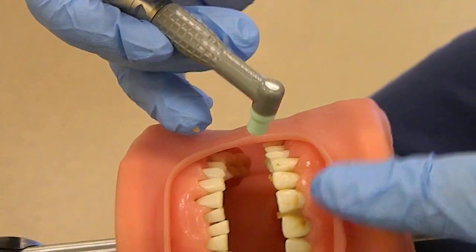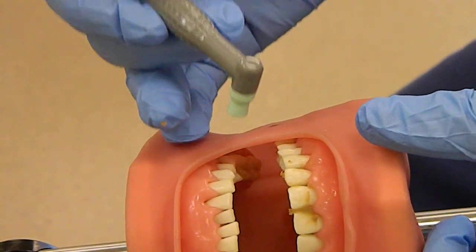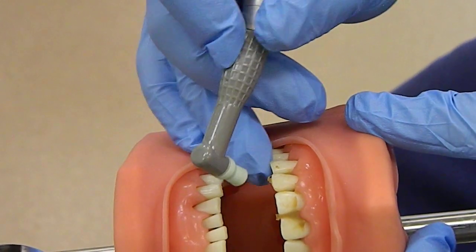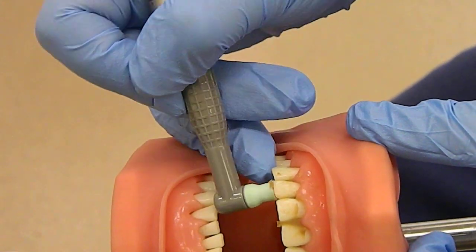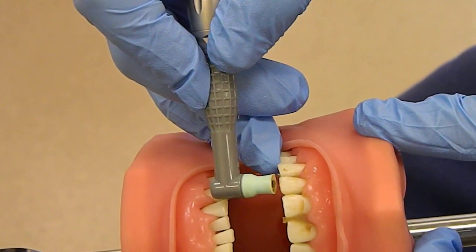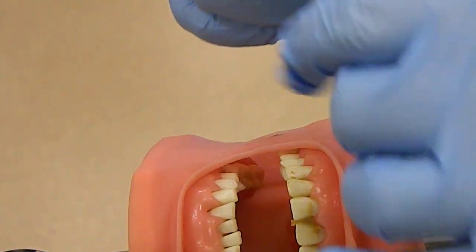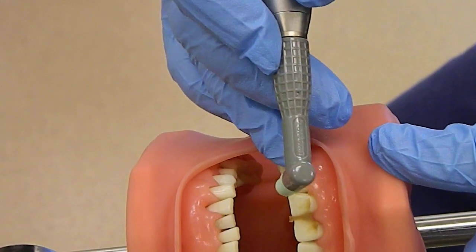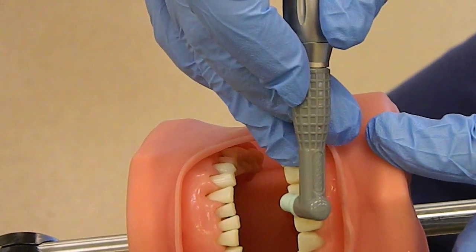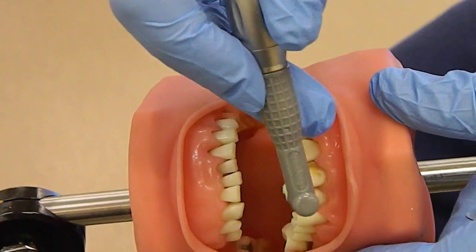It's going to be hard to have a fulcrum here. You can have an extra-oral fulcrum on a hard surface like the cheekbone or the chin. If you can get a fulcrum on the tooth, that would be fine as well — usually use that for the lingual surfaces. So you want to go down the center, flaring the cup at the gum line, side, side, and just make your way all the way around.